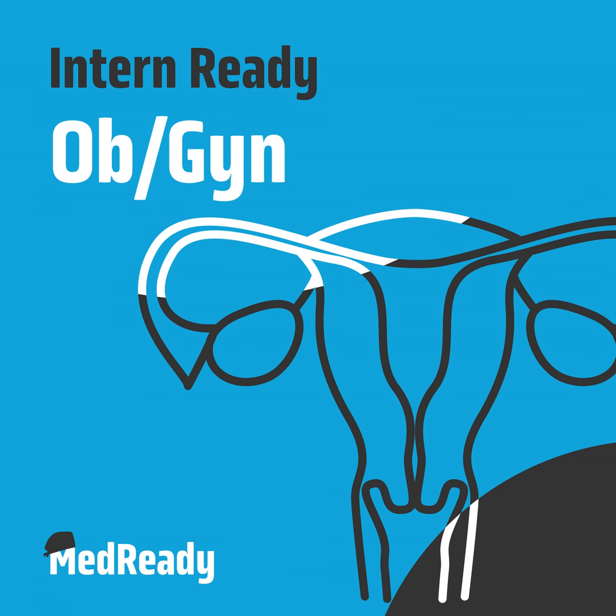So this is the inner component that has the actual lens. There are a few different types of viewing angles that you can do. So you'll sometimes hear your attending call for a 0 degree or a 30 degree. This just gives you a different angle with the telescope. So a 0 degree is forward viewing, where you're pointing is pretty much exactly where the telescope is viewing. A 30 degree has a little bit more of a lateral view, and so sometimes people will use that for more difficult angles or corners that require a little bit more maneuvering to be able to see.